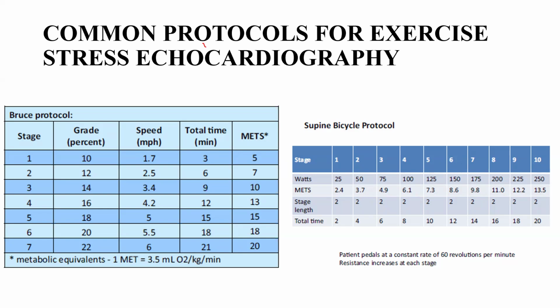The benefit of treadmill over the others is that for treadmill, you are able to give the adequate workload; optimal workload is physiological. There are some references which say that even for the bicycle protocol stress test, you might not be able to achieve even 85% of the maximum predicted heart rate. So they may define what a positive test result is at a particular rate pressure product.